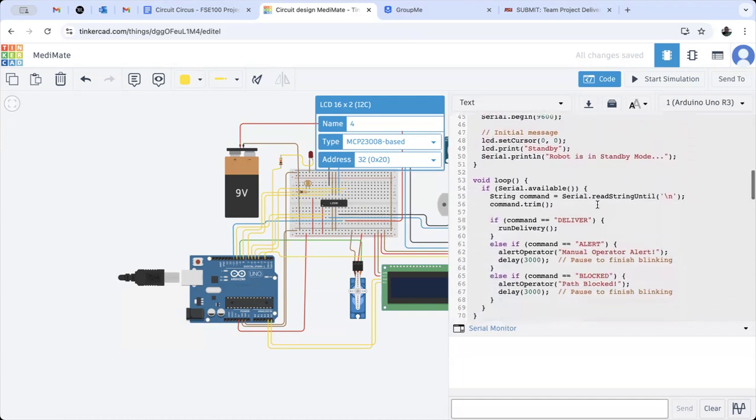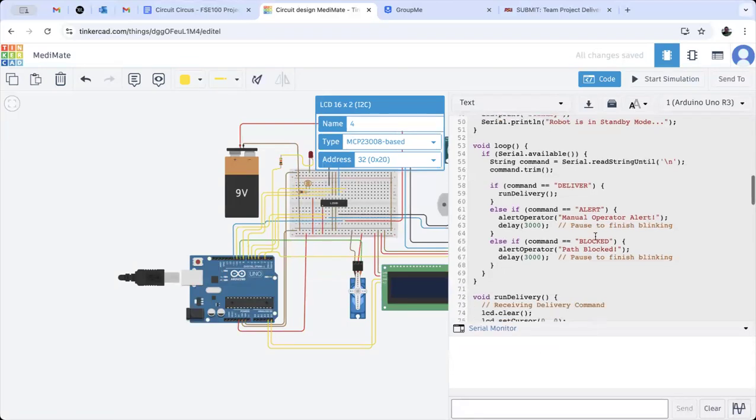So the robot is going to start in standby mode, and it'll print out that the robot is in standby mode. And then if the command is deliver, it will run the delivery function. Then we have two different alerts. The first one is just a general alert, and that is for maybe the patient ID is not correct. We want to alert the operator for that. And then the other is block. So if that path is not clear, it will block.